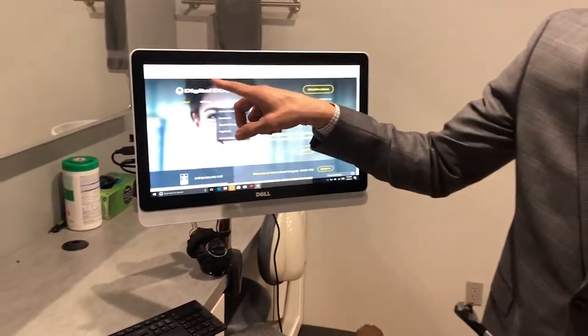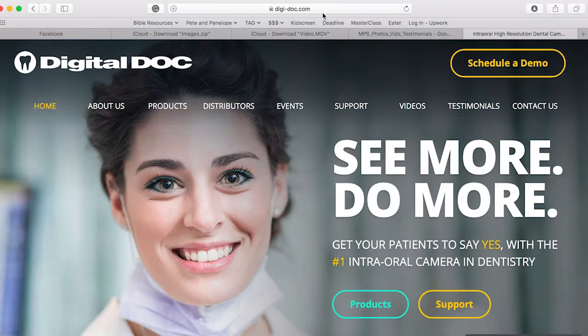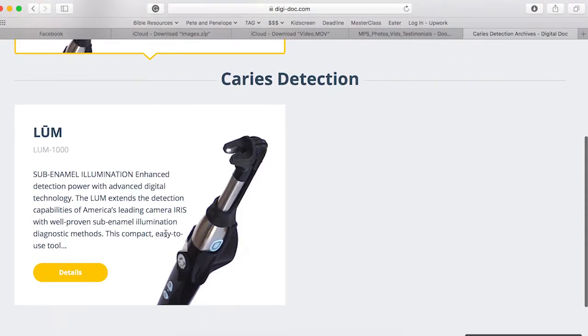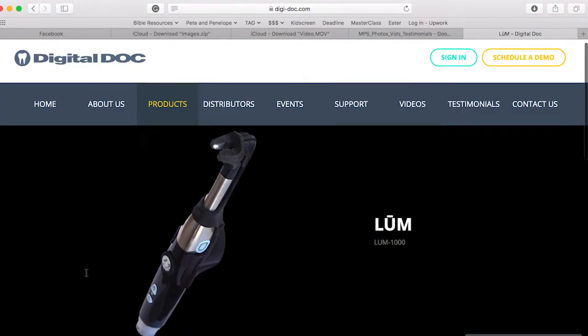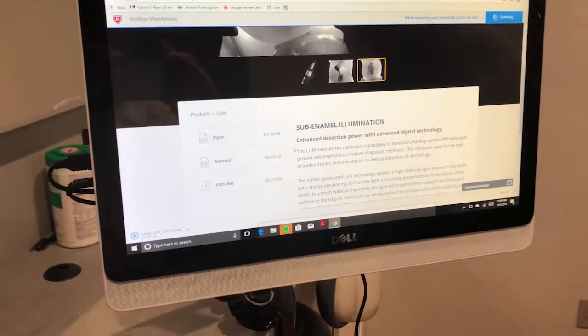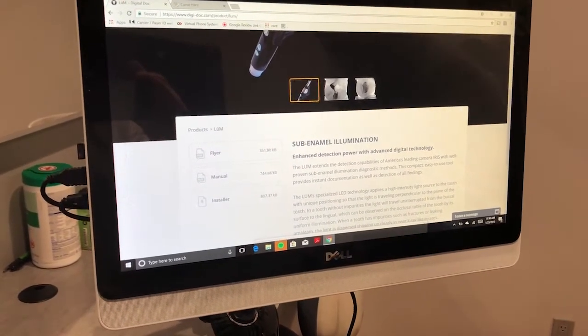Let's start by going to digi-doc.com. Choose Products, then Caries Detection, simply scroll down, click Details, and then your installer. Once you run the installer, you'll see a couple of quick clicks — next, next, next, yes, install.